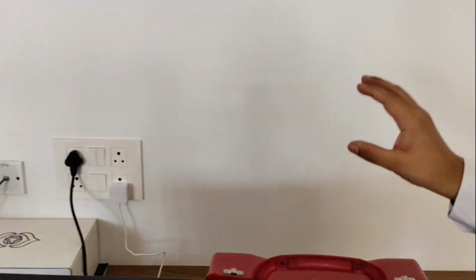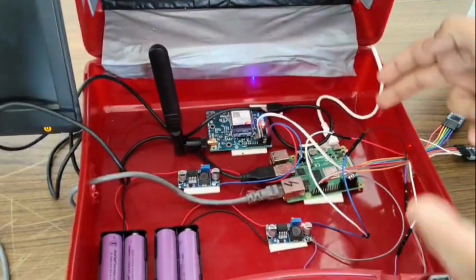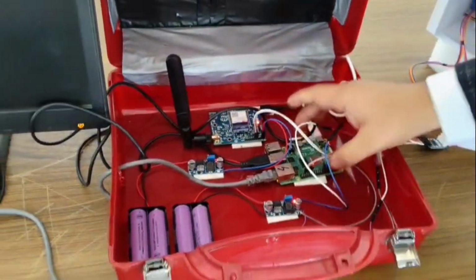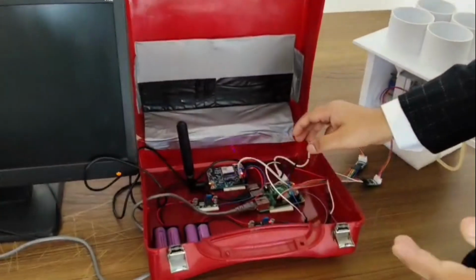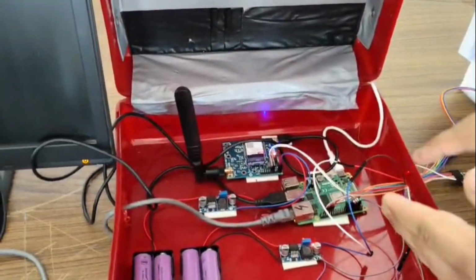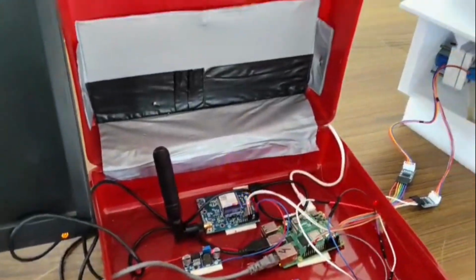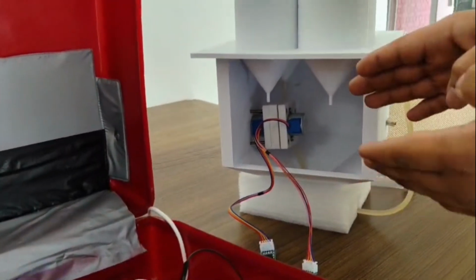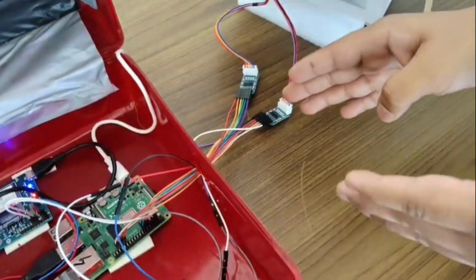Let's come to the power input, which is provided by the Raspberry Pi official adapter of 5 volts 3 amps to power the Raspberry Pi for stable working. The main function of the Raspberry Pi is to do all the computation for the command that is coming from the doctor portal through the 4G module and getting stored at the 4G module, which is then accessed by the Raspberry Pi through AT commands and decoded by the Raspberry Pi for providing instructions to our unipolar stepper motors that are driving our peristaltic pump through ULN2003A motor drivers.